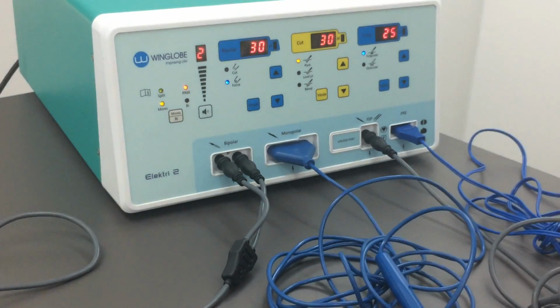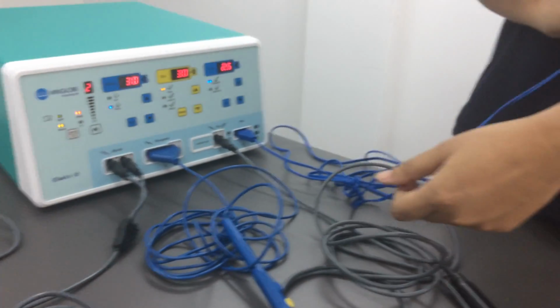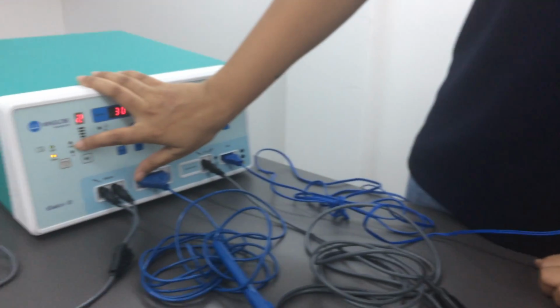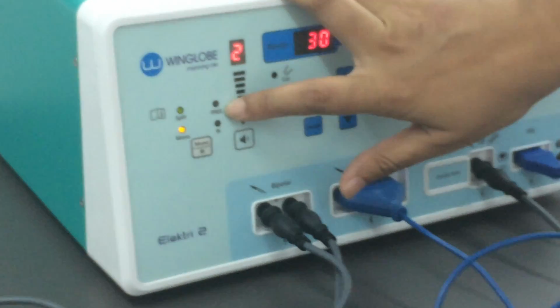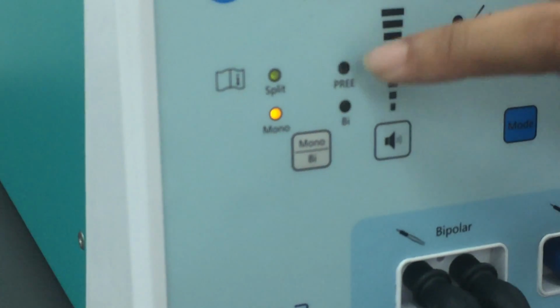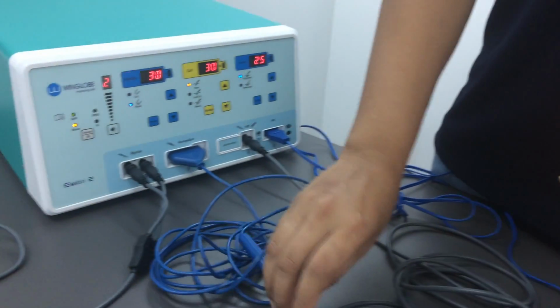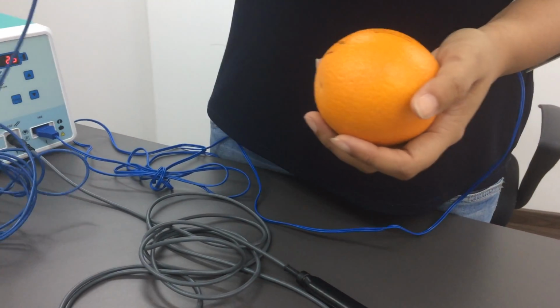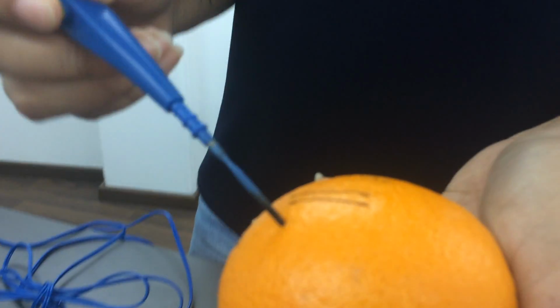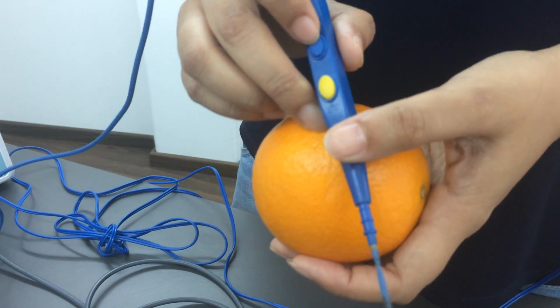For this demonstration, I will be applying the split pad on myself, and you can see that the error light has gone off, which means that it is in contact with the patient body correctly. I will hold the orange in my hand and I will activate the pencil on it, thereby completing the entire circuit. Because this is a hand switching pencil, I will be using the hand switch buttons.